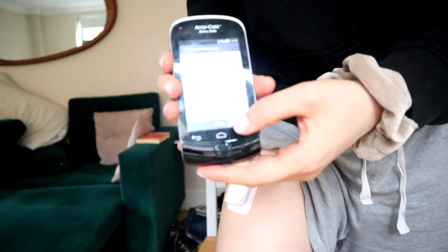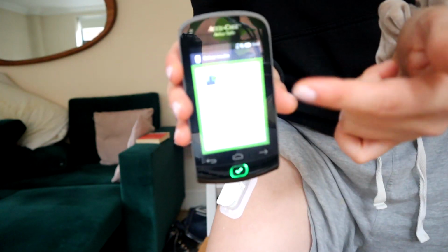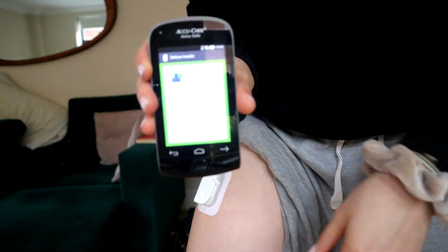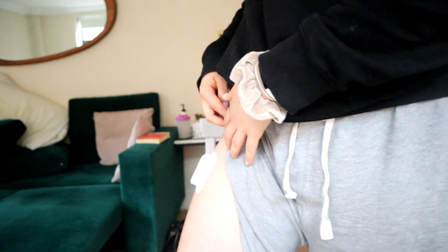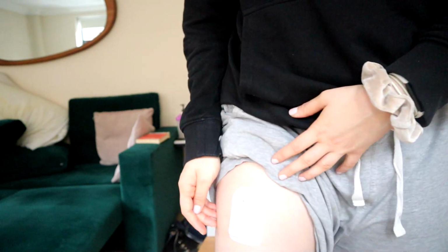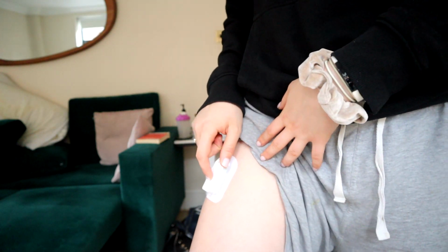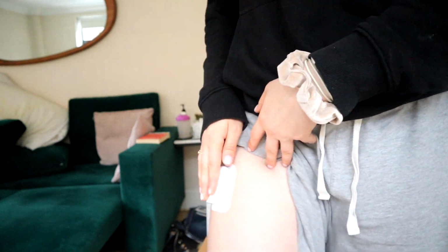We can now press next on here, and you can't really see that screen, but basically it's saying, do you want to start your basal insulin going again? And we just click the green button, yes, and then it will start the insulin going again. So you can kind of see that's how much it sticks out, that's how big it is on the body compared to the palm of my hand. And that's how you attach it and detach it, and then you can just walk around with the pump on. So there we go, that is how to put on the Roche Solo pump, how it attaches and detaches.